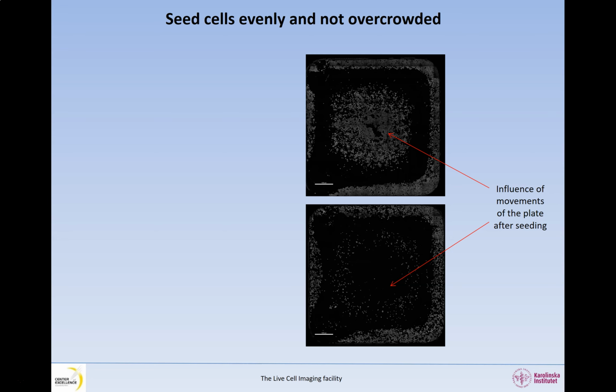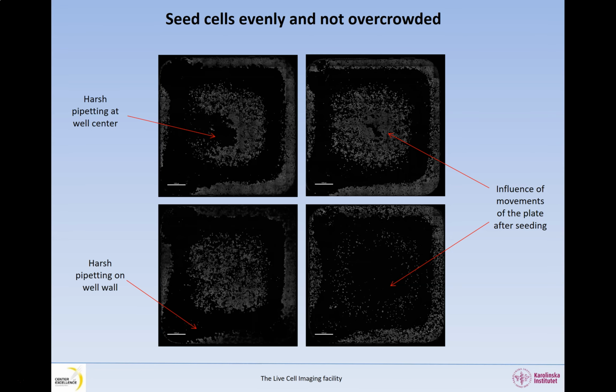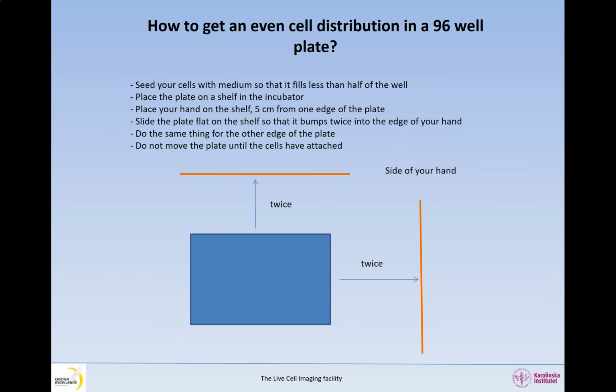After the cells attach, treat them gently and avoid harsh pipetting at the well center or the well wall, as illustrated in the image on the left.